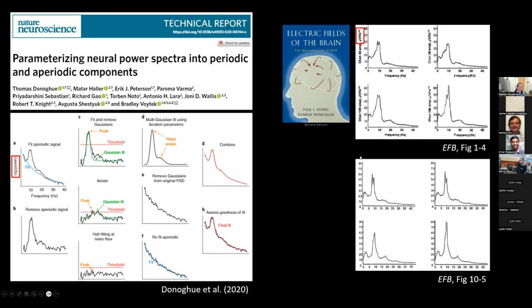So how much we care about the artifact really is a fundamental issue. And I talk about these things first because these artifacts may or may not be treated in later signal processing. So there are things we can do and cannot do in signal processing, right? Someone said garbage in, garbage out. But when we take this garbage first, we might even take it as the basis of how we see the data. For example, 1/f in the power spectral density is considered a natural property of the EEG signal, but is that really so? This is a really fundamental question, right? So we have to remember this.